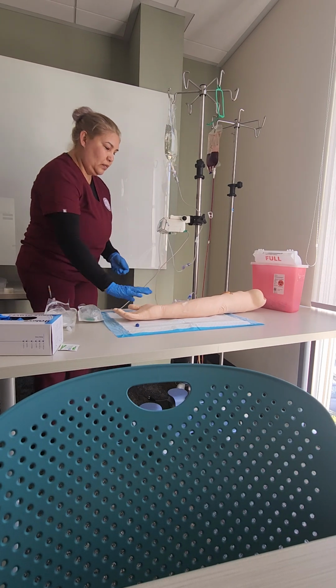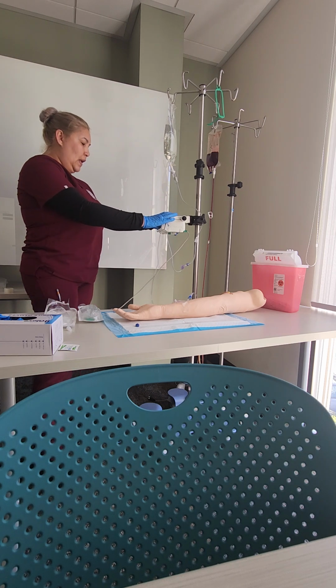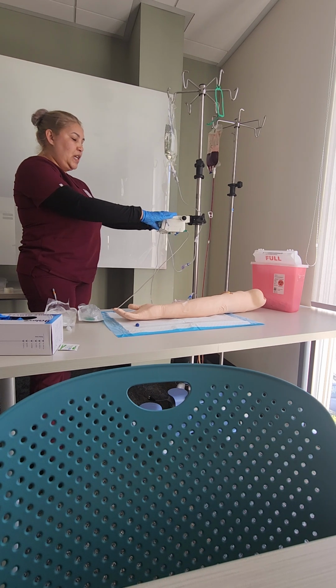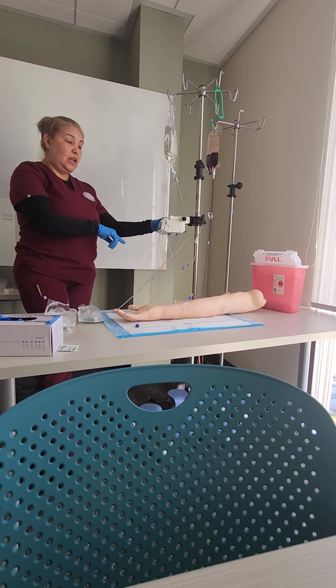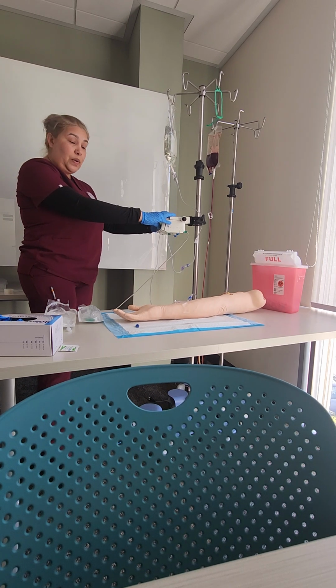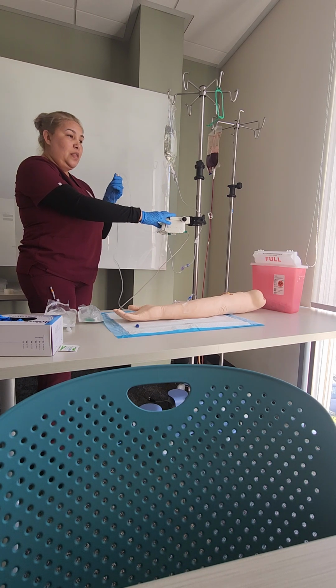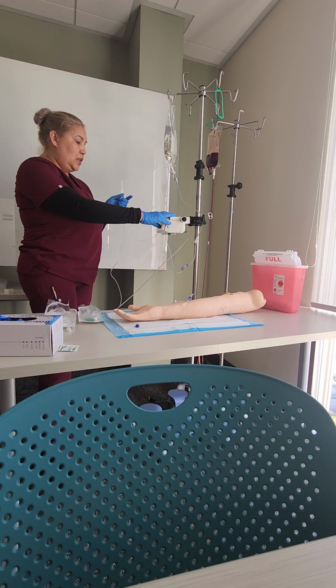Okay, that one is going. I want to say primary to be infused. Perfect. And now I have confirmed again the rate and the volume that is going to be infused. Now I want to say start. Before I start, I want to make sure that my clamp is open. So it's asking me if I want to start, and I said yes.